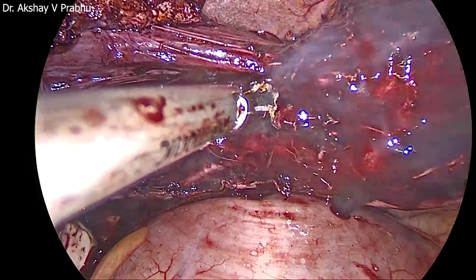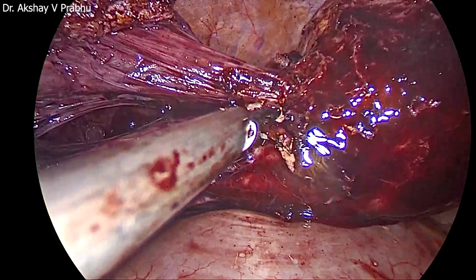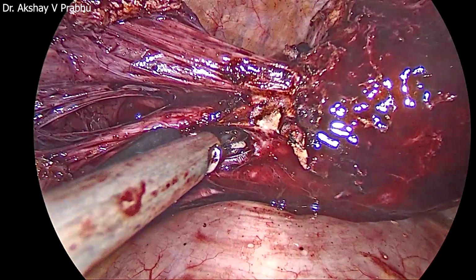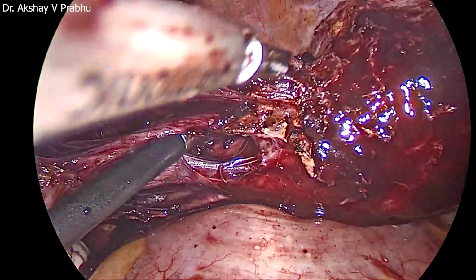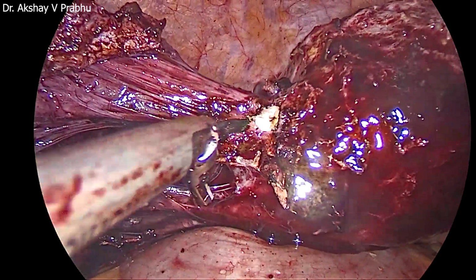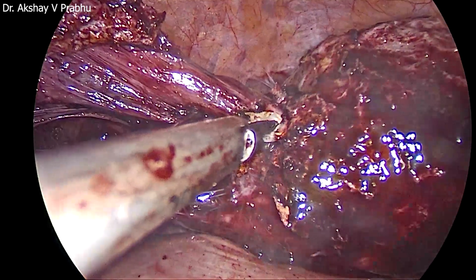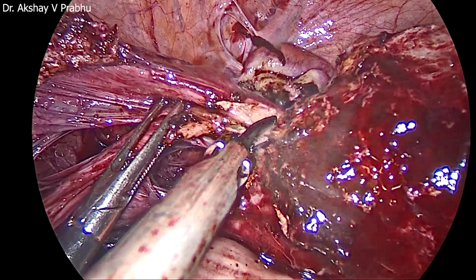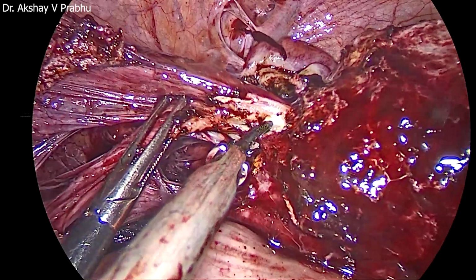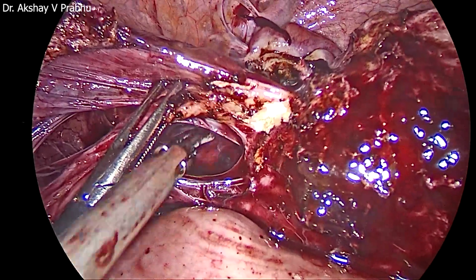I've again revised the tissue planes. If you can see that yellow part, that is a part of the previous scar. That's how it appears. Previous scar always appears in that manner. I'm cutting more close to the uterus now, just to be sure. Ideally, you have to cut slightly below the scar tissue, but in this case, because anatomy is so distorted, I am cutting through the scar tissue, very slowly and millimeter by millimeter, because with every cut, a new plane will be exposed. Now that's very clear.